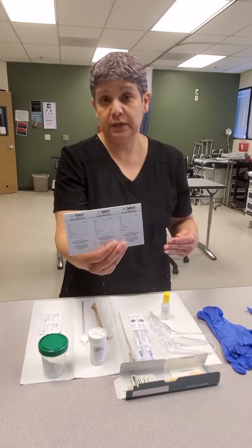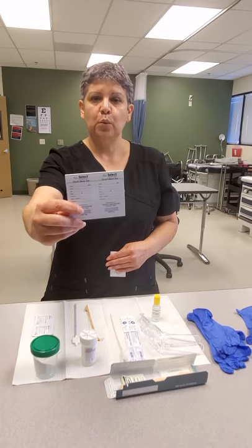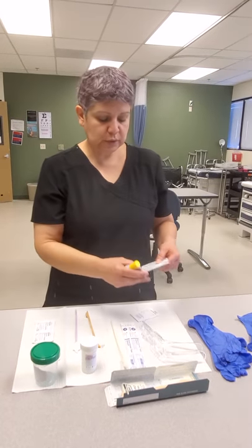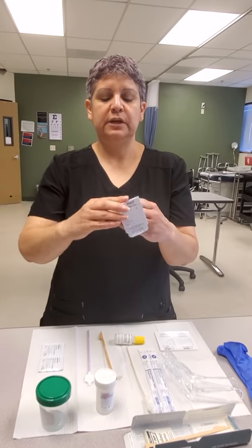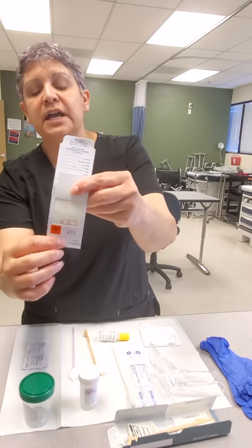We also have the occult blood test — this is the rectal exam test. We are looking for hidden blood in the stool, which is a precursor for colon cancer. If we get a positive on the one we do in the office, we send two home with the patient to do over the next two days and bring back to read for results. We use a developer — the card has two little windows visible from both sides.